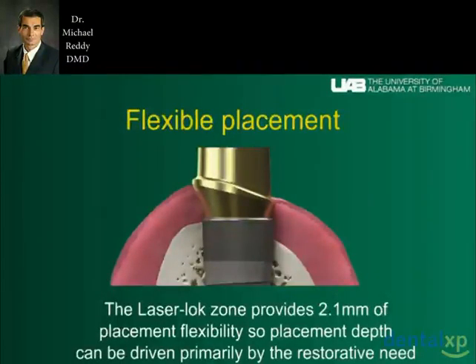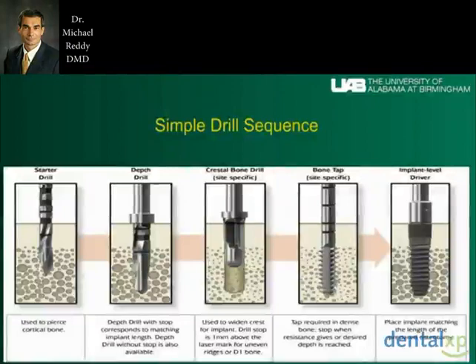So this, as opposed to the one-piece implant, is a significant improvement, because instead of having that machined surface, and we know that bone and non-mineralized connective tissue don't really like a machined surface, this highly oriented laser ablated microchannel surface is something that the connective tissue, both the soft tissue and the bone, will actually adhere to. In a case like this, where you have a changing crest of bone, it allows you to not be too concerned about the placement. It's okay if the implant is a little above the crest of the bone.